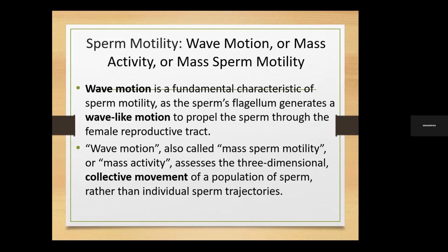As we move along, I will introduce you to how we do it in the lab and how it also helps you get a fair knowledge about your motility. Once you have done your wave motion test, if your motility or sperm count gives you a different story, you should know that something is wrong somewhere along the line. It's like those people who go for the gram stain, they do what they call sampling. They go and take a certain aspect.